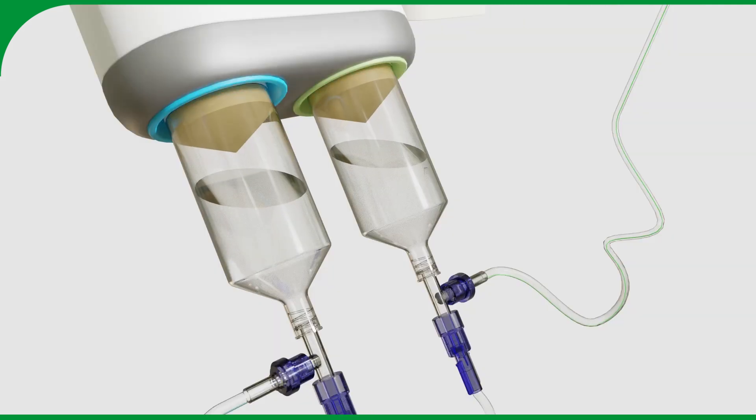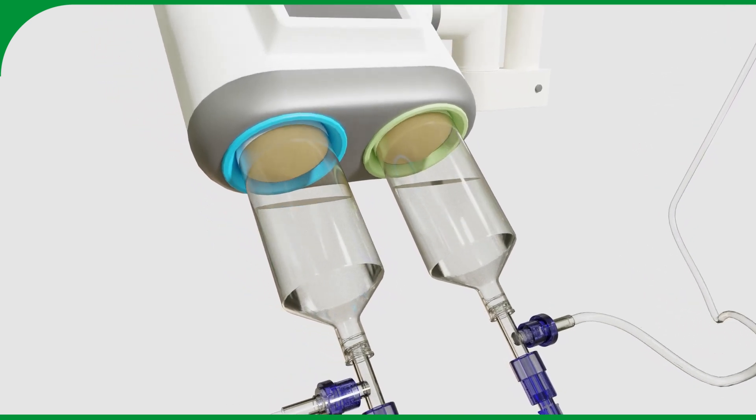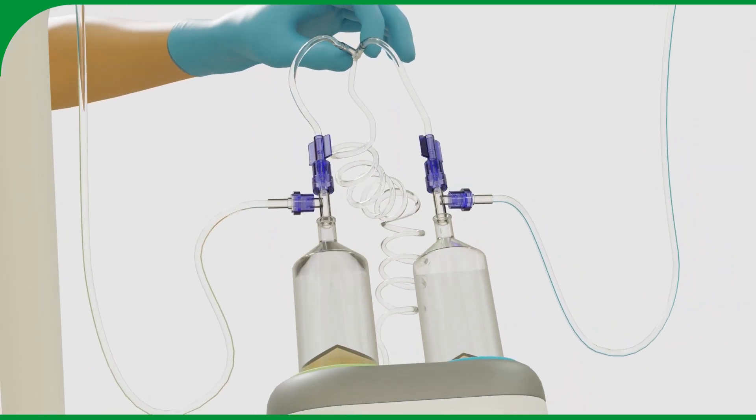Fill the syringes with contrast medium and saline using the injector. To remove any air from the system, it is best to turn the injector upside down and hold the Y-part of the filling line upright while filling.